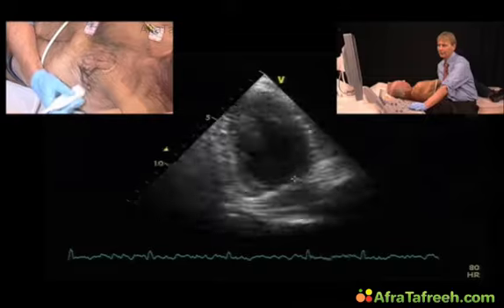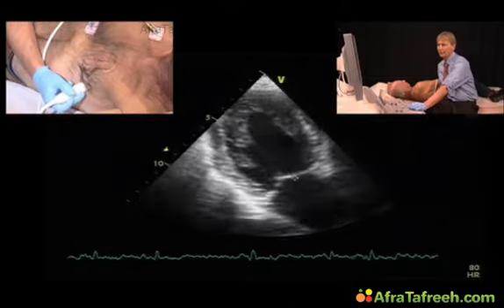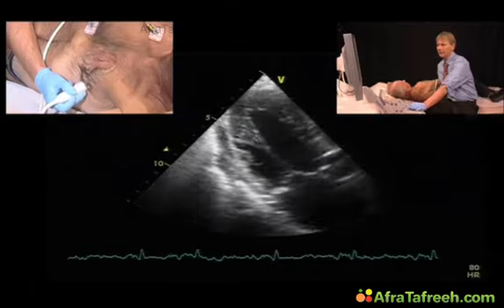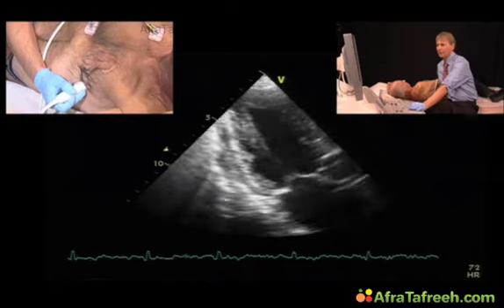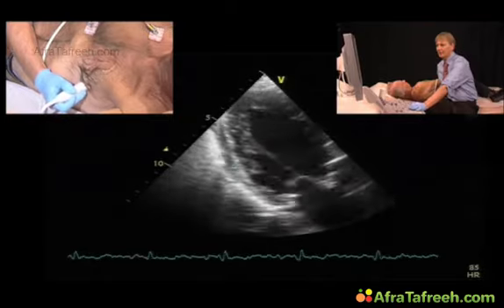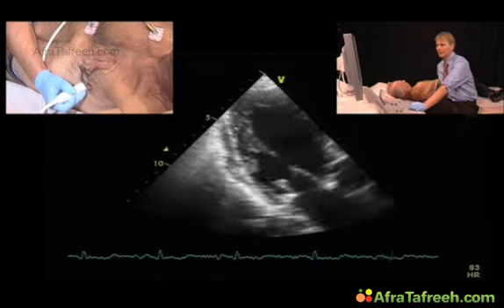And then I will turn the transducer more towards the posterolateral region. And again, you can see there's a scar here. You always have to watch out. The papillary muscle obviously is still moving, but the scar seems to go all the way up to here. So this is all scar and akinesis. And there also seems to be some degree of dyskinesia of the posterolateral wall.